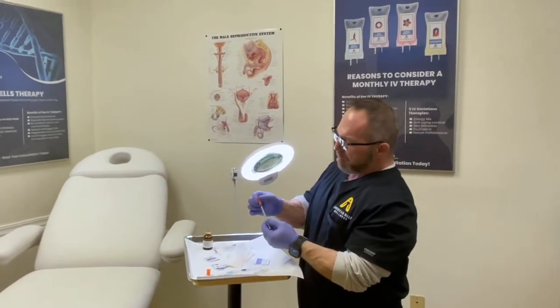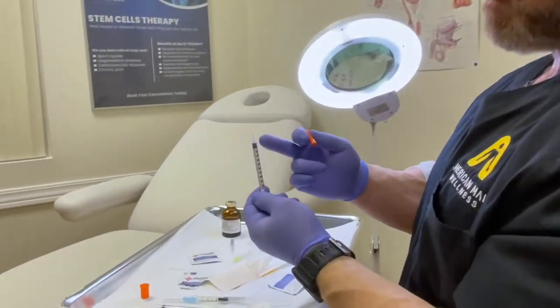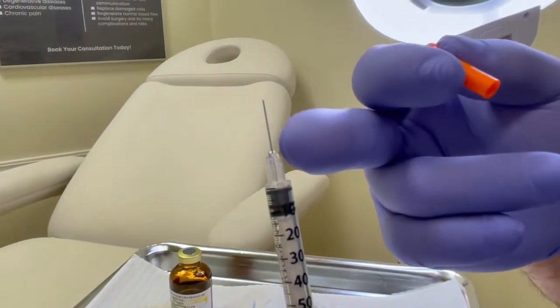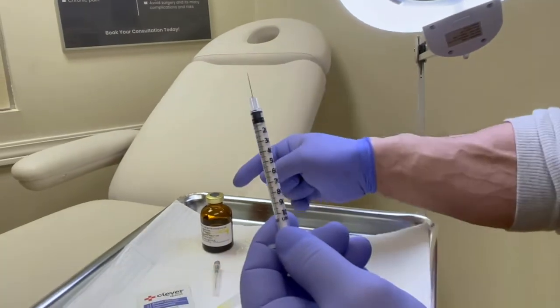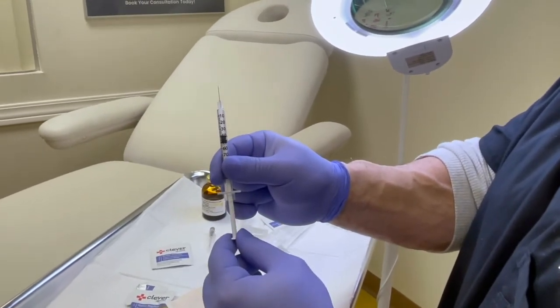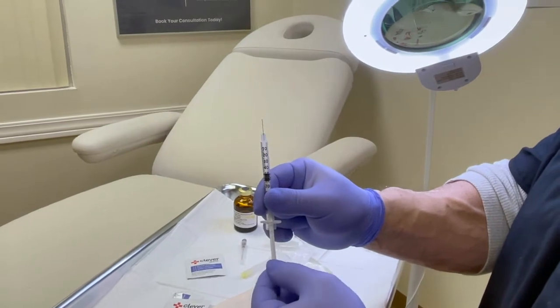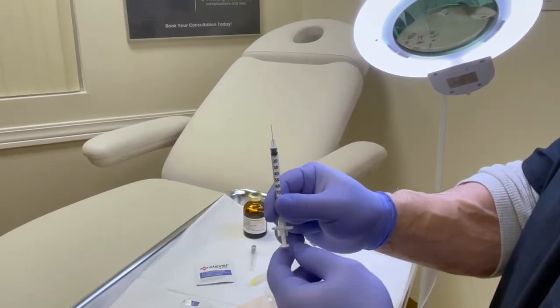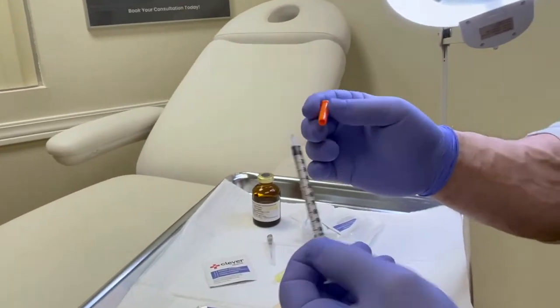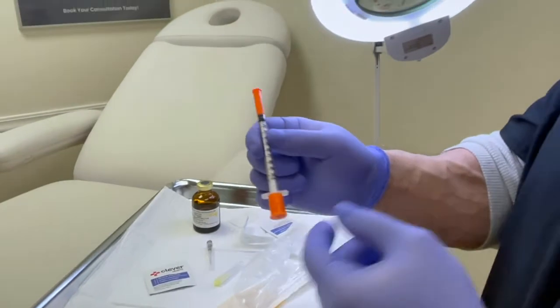There's also a practical problem with insulin syringes: you can't luer lock them — the needle doesn't come off. The needle is very fine, and the viscosity of oil-based testosterone makes it nearly impossible to draw into this syringe. Insulin syringes are designed for aqueous, water-based insulin, which is much thinner. The syringe is sterile when it comes out of the package, and that matters.